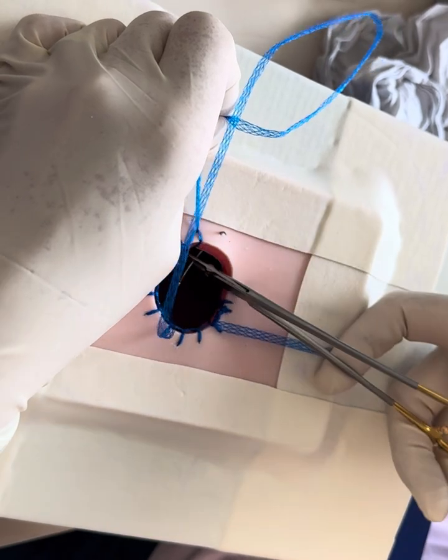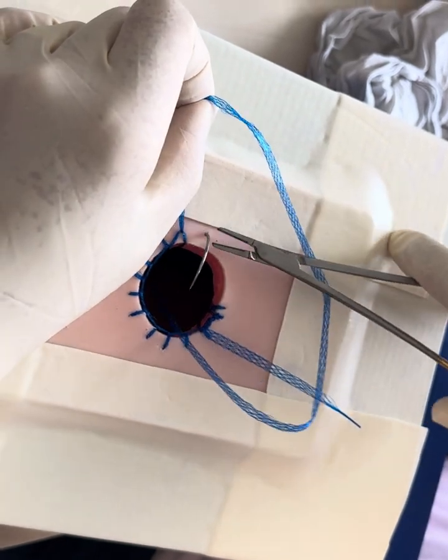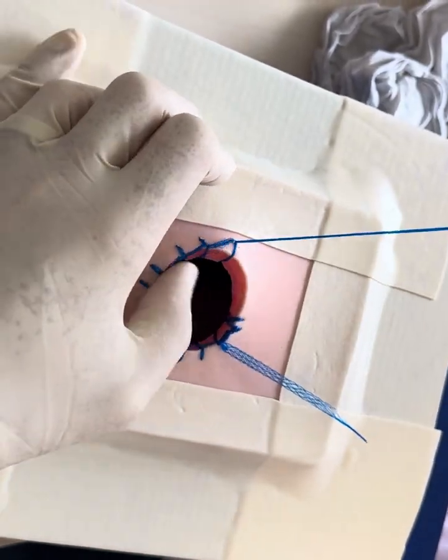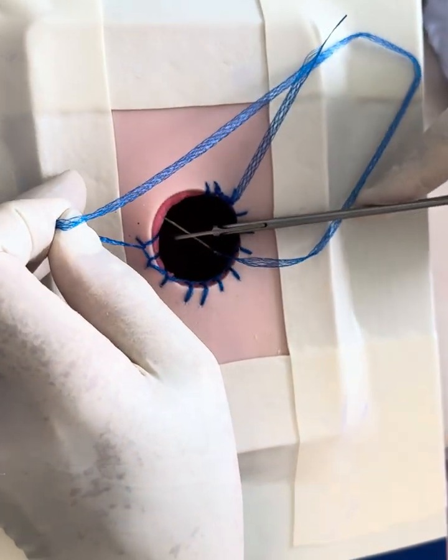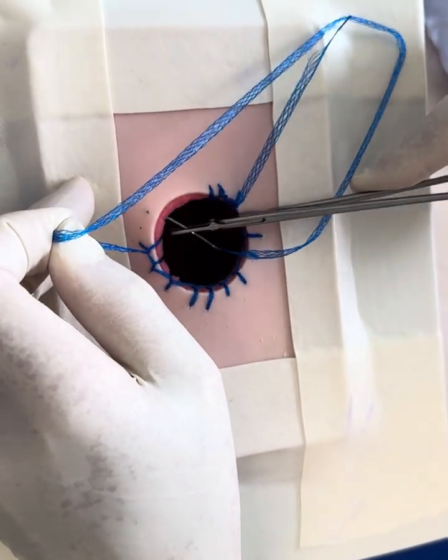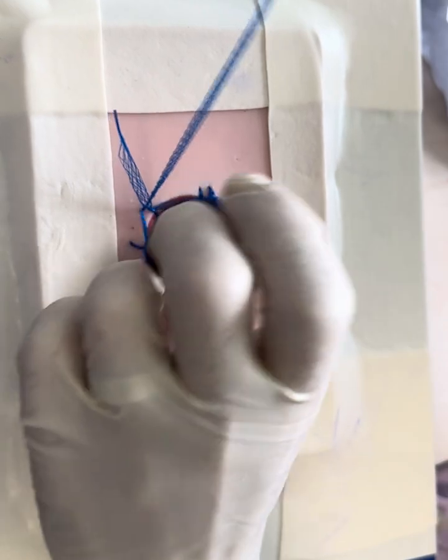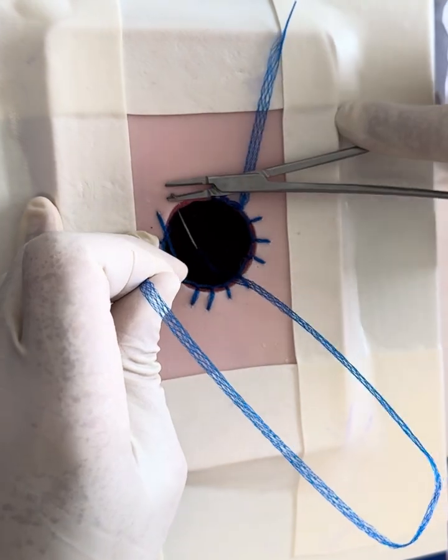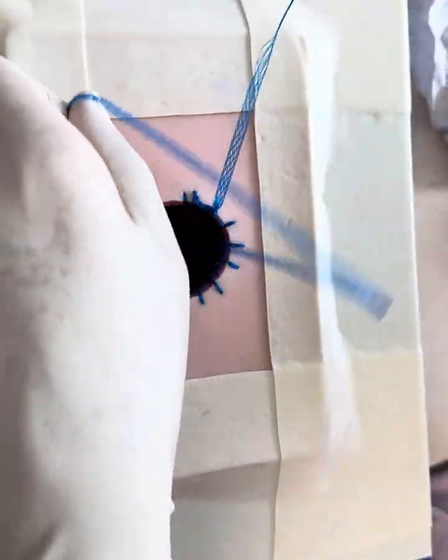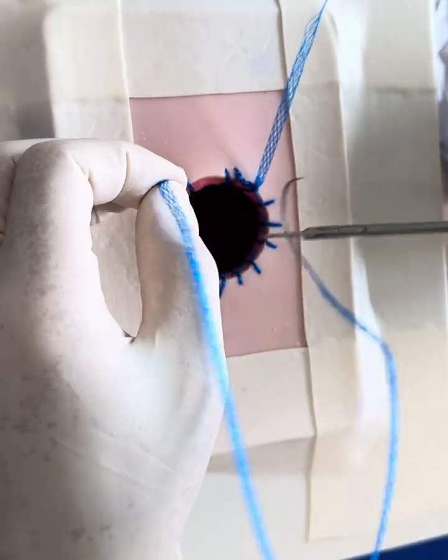Slightly easier on human tissues. There's the needle. There's quite a lot of friction, but that's all okay. Just going to move my model rather than move around my patient. Just trying to keep everything even. There's 5 millimeters of depth, 1 centimeter progressions, just to keep symmetry to the repair, to keep the Duramesh sitting nicely in contact with all the tissues.